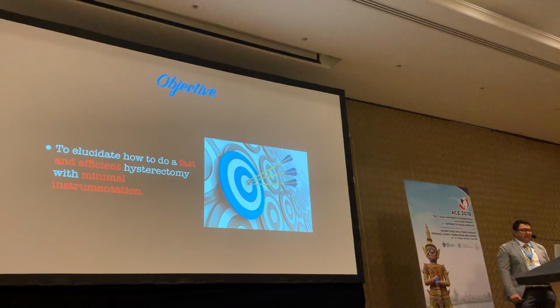So the objective of my talk is to elucidate how to do a fast and efficient hysterectomy with minimal instrumentation. I'm saying fast, not by doing quick, rash movements. You achieve speed in laparoscopy by minimizing your bleeding, sticking very closely to anatomical surgical planes, and not using suction irrigation. So that's how you increase your speed by not changing instruments. I'll show you through the steps. I use about 3 instruments till the hysterectomy is complete, just interchanging the ports.